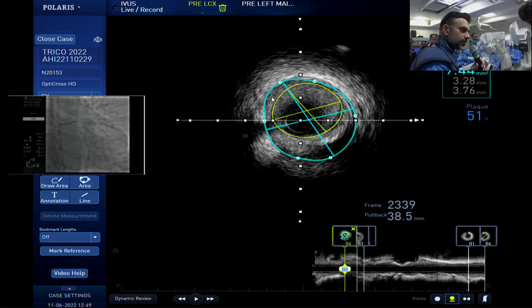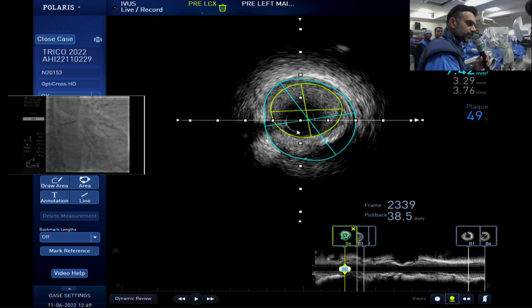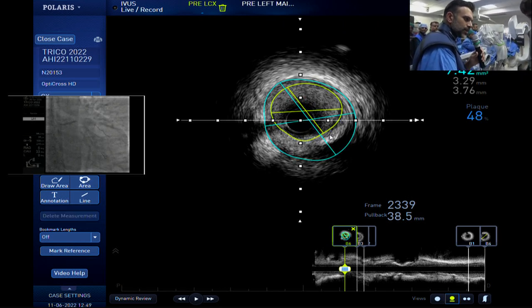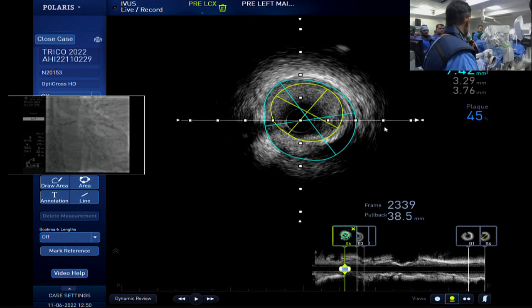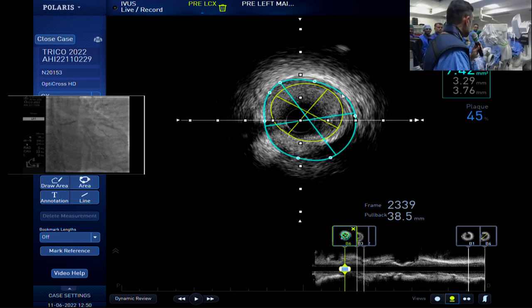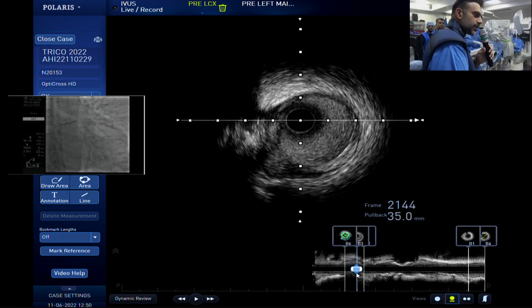Though, as I said, I don't use TRACE assist very much because I don't like it that much. I'd rather do it manually, so you get the experience using the catheter and the technique, right? So you're less than 50% plaque, right? So if you're stuck, you can land here. You just have to go lumen to lumen, okay? But your best landing zone is about here, right?